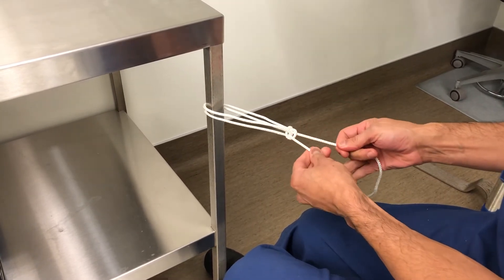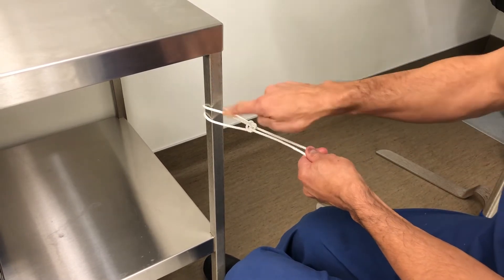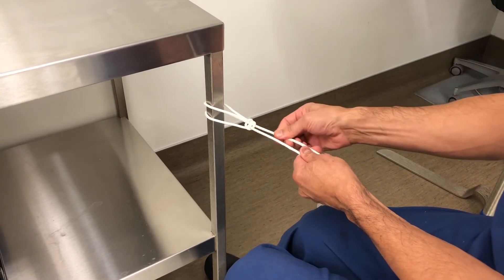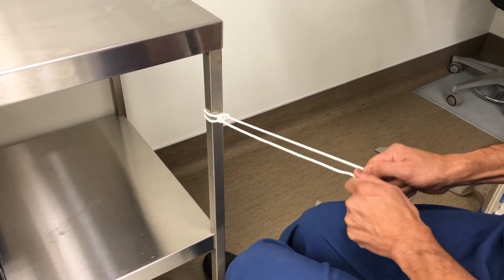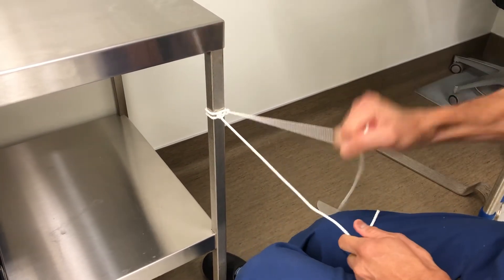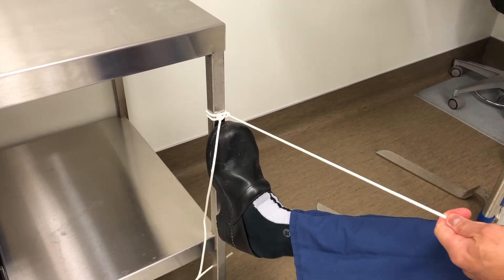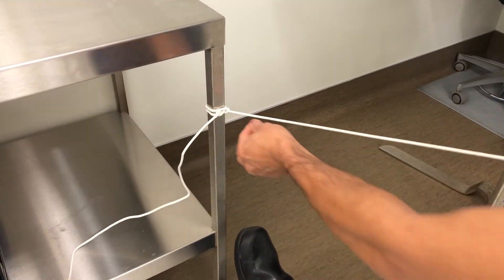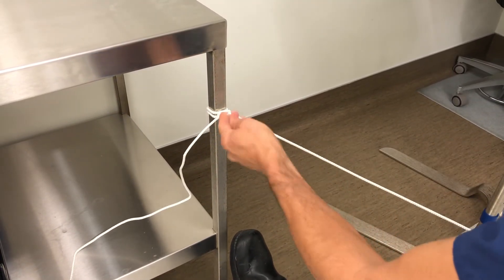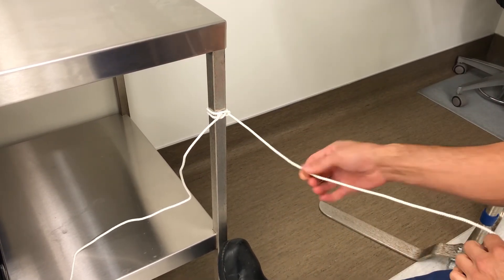And then you slide — look at this — you still have four limbs going through the tendon. It locks itself, so it's not going to come out like the luggage tag. And then you can trim this piece right here, and now you have one. So if you have three or four of these, you only have one limb that you have to manage through an anchor.